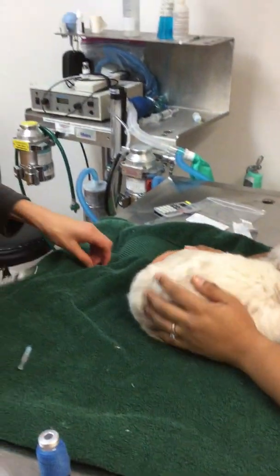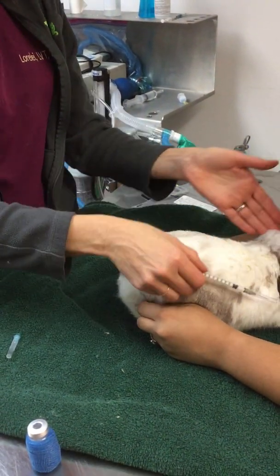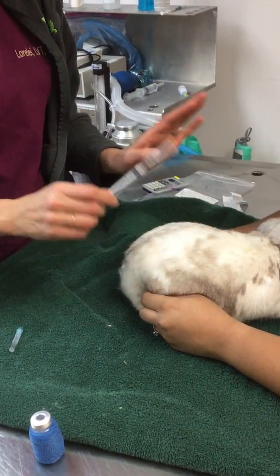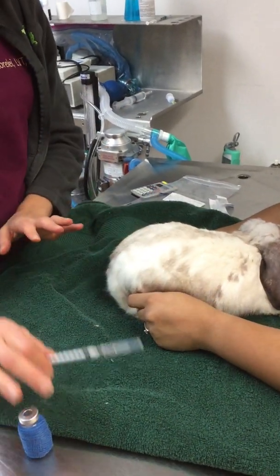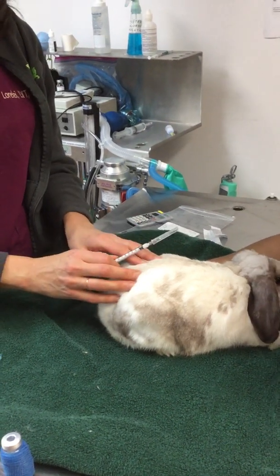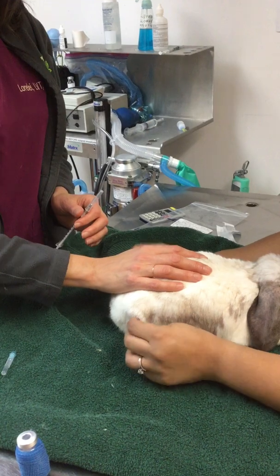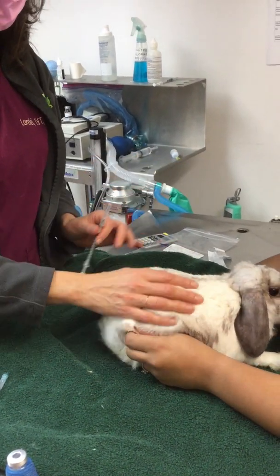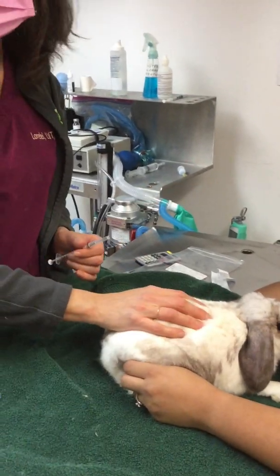Now listen, it is not a big deal if you go through the skin and the medicine spills outside of the rabbit — it's totally okay. Don't stress out. Just regroup. Draw your medicine up again and start over. It's okay. These are small needles. You're not going to hurt your bunny. Just take a deep breath, give it another try, and you'll get the hang of it. That's it. Good luck.